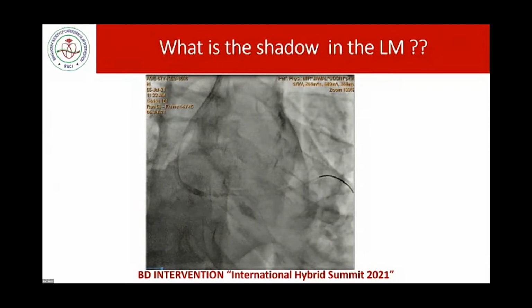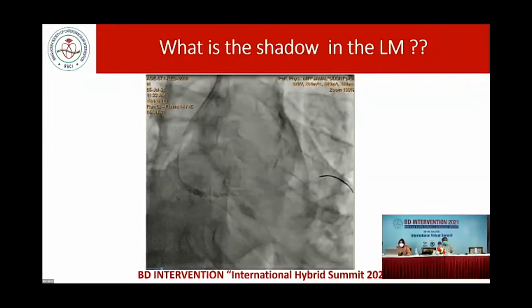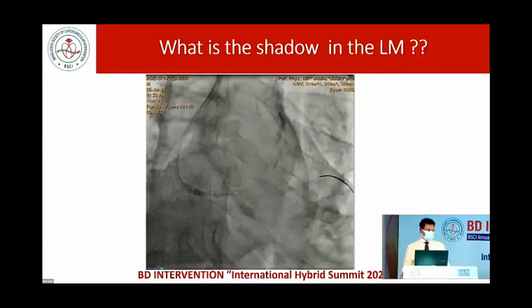Are you seeing? Are you seeing, faculties? Can you maximize the screen? This is the maximized, no more. And you are seeing something in the left main in a coiled fashion. Are you seeing, Dr. Mahbub? Yes, yes. Okay.